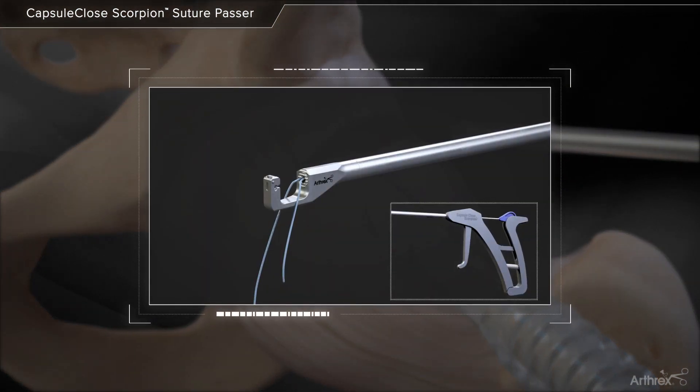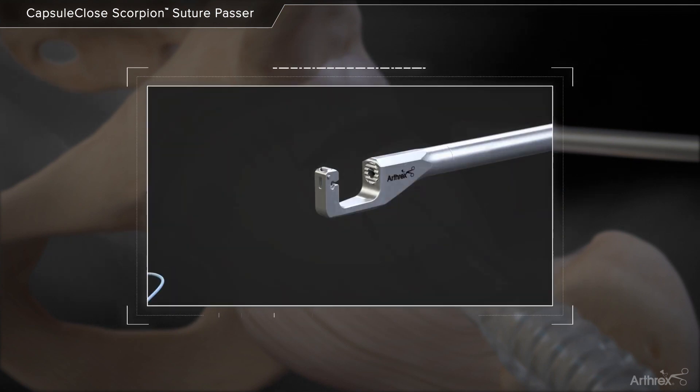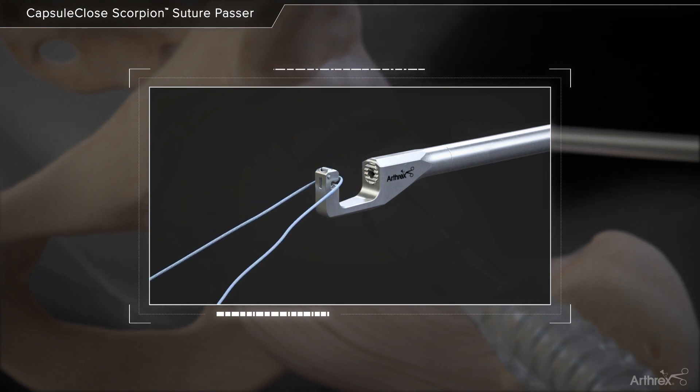To release the fiber wire suture from the needle, squeeze the rear handle until the needle advances. In preparing for the second pass through the capsule, load the opposite end of the fiber wire suture into the small slot as done previously.